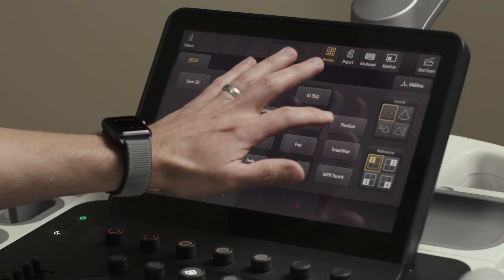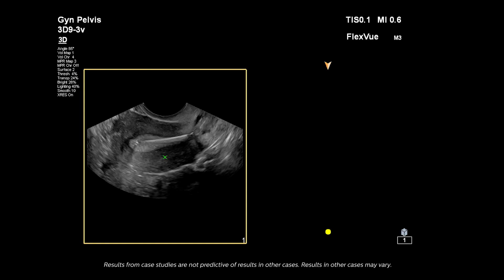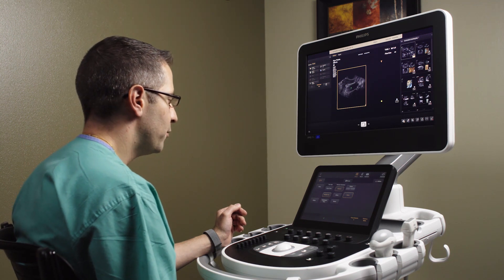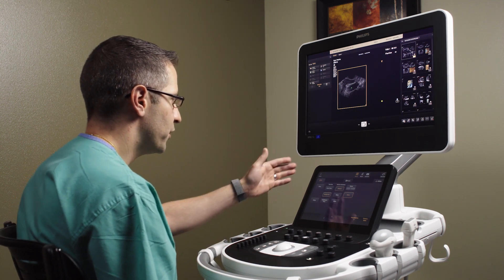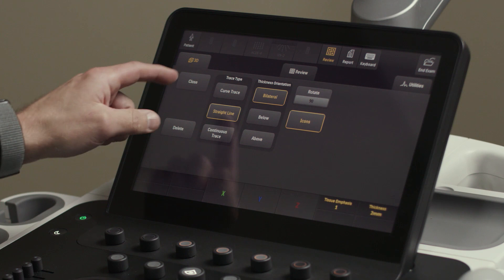We're going to select FlexView as this new feature. You can see a longitudinal or sagittal image of the uterus, clearly able to see the myometrium of the uterus and the endometrium well. And we have a few different choices here for trace type.